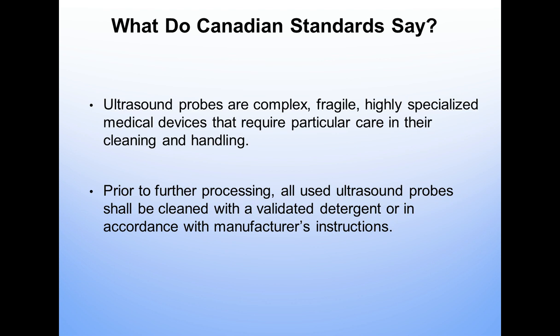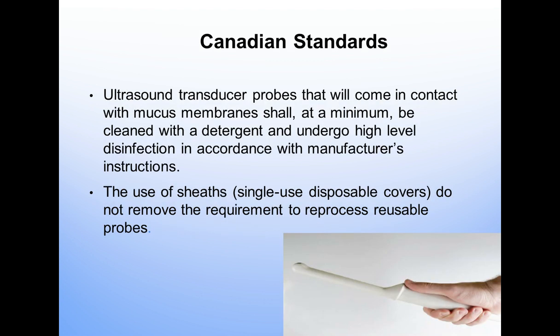I haven't said too much about manufacturer's instructions. However, in adjunct to the standards, the manufacturer's instructions are critical, and it's important that those are reviewed and your protocols and policies are written based on the standards and the manufacturer's instructions.